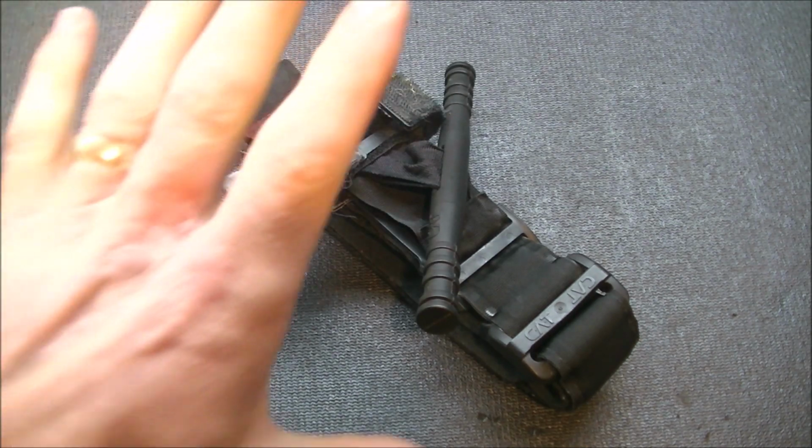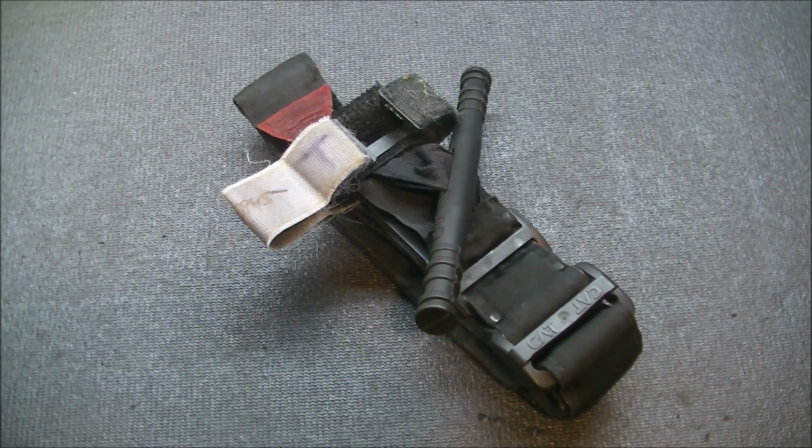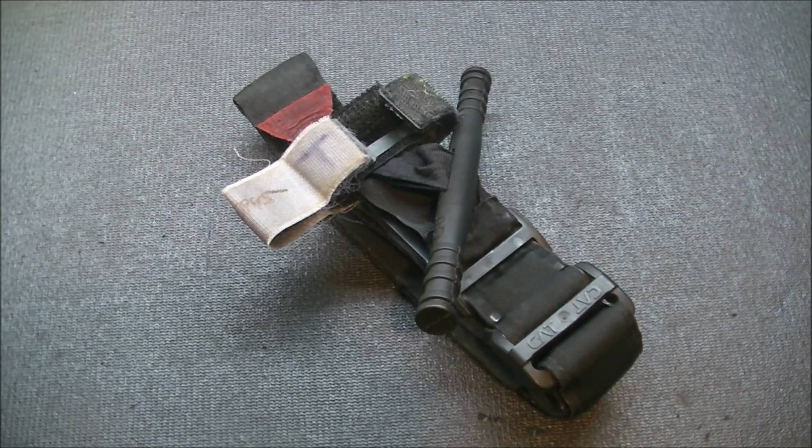That's why these are also not very good for small-limbed individuals, like the people in Africa who are generally going through some phase of starvation. They are not going to really be able to use the CAT tourniquet because their arms and legs are just not big enough. So that's where you have to look at different alternatives that will work. And they also don't work for canines either.